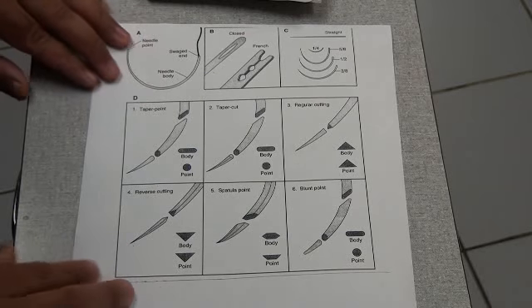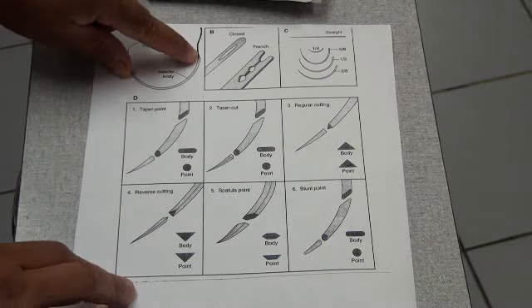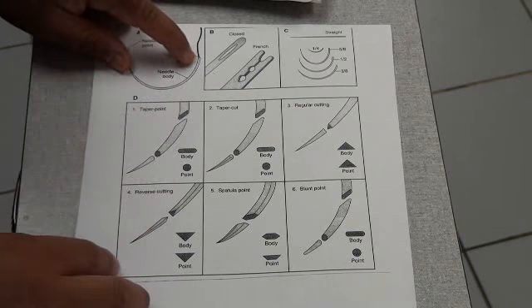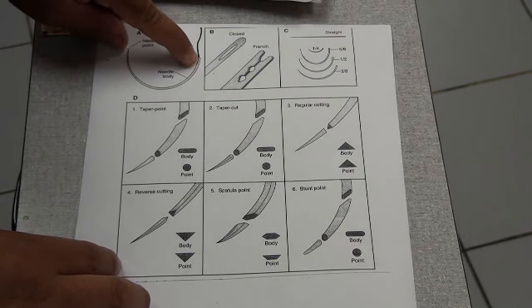The other type is a swaged end needle, where in the process of making the needle and the suture, the needle is made onto the end of the suture material. So it's like the suture's in a little hollow tube where the needle ends.